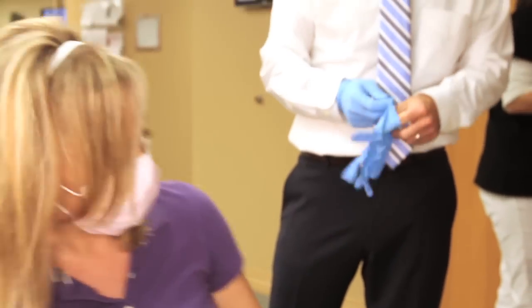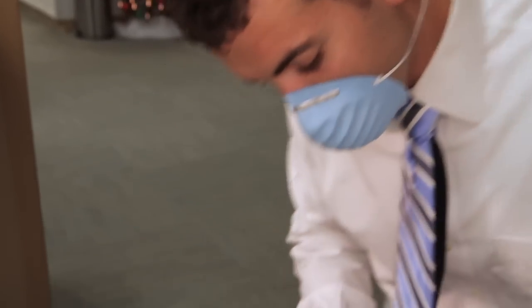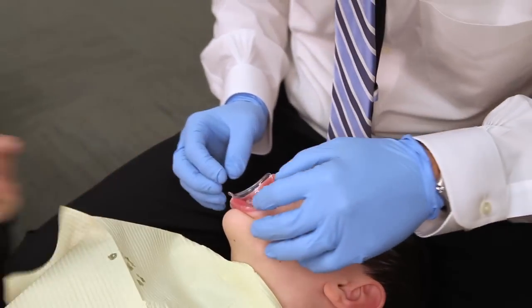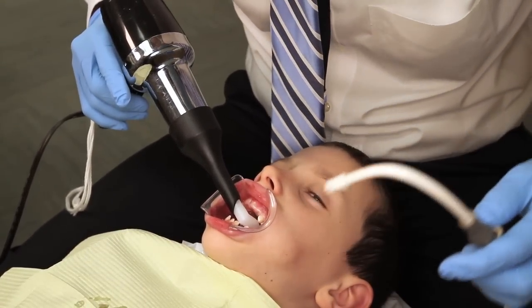After the patient manager removes the excess sealant, the orthodontist will come to the chair. The orthodontist is going to make sure that everything looks good. He will place the tooth dryer on the teeth and suction any excess saliva.